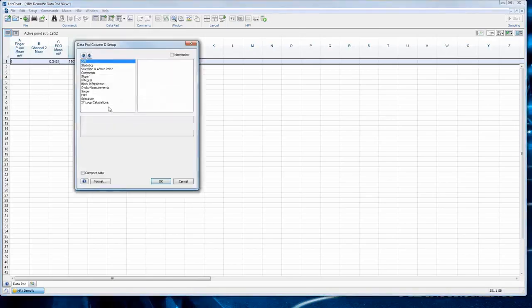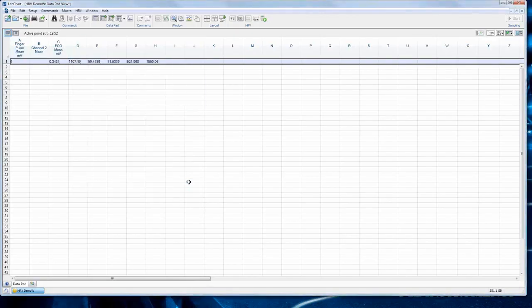And of course, there's a few other things we can do here as well. So, like I said, things that were there before in HRV 1 point whatever are available here in the datapad as they always have been, with a few tweaks, changing some of the calculated parameters to update it to the current HRV analysis. So this brings us to the end of my presentation today.